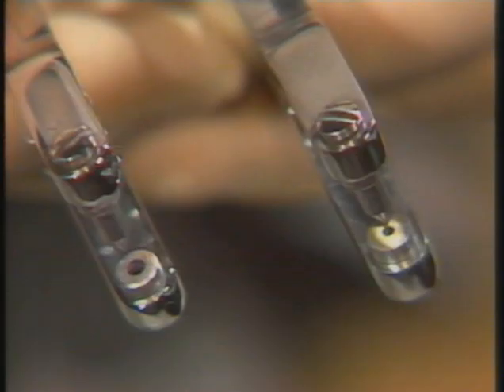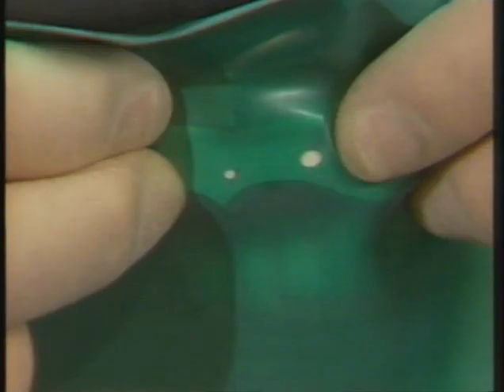If you find that the punching of the hole is incomplete, or if there's a tear in its periphery, then obviously the dam will tend to tear itself when it's stretched. To ensure accurate and clean punching of the dam, these fixed table punches give much greater certainty of location of the punch in the anvil. And as has already been said, 2 punch sizes should deal with every situation.